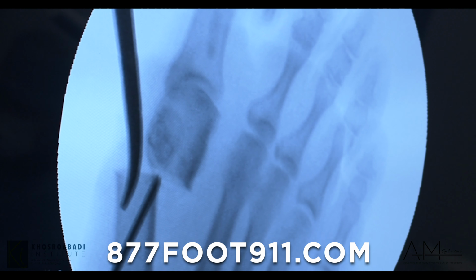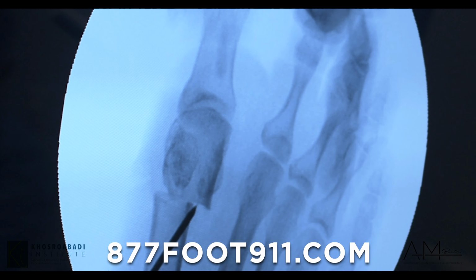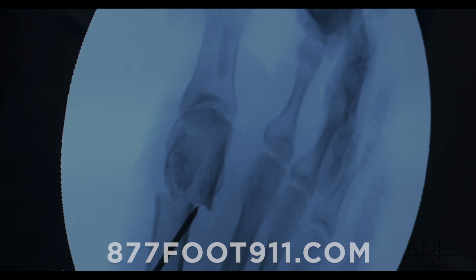Resect a little more of the wedge. Once I do that, then it falls into place perfectly. Let's see.